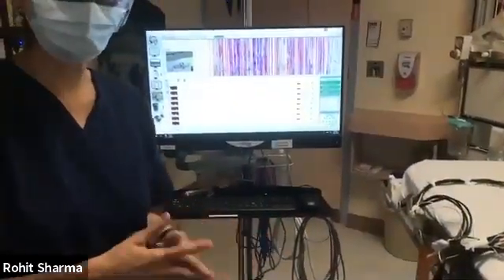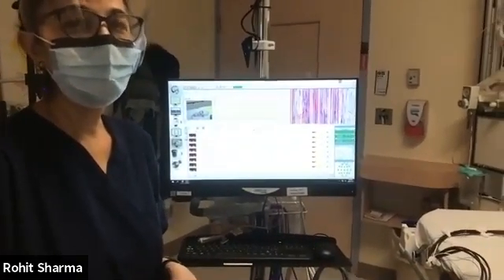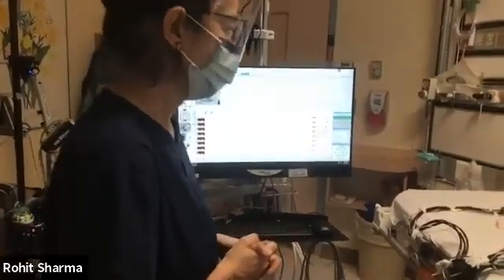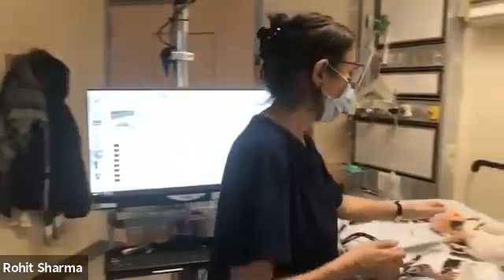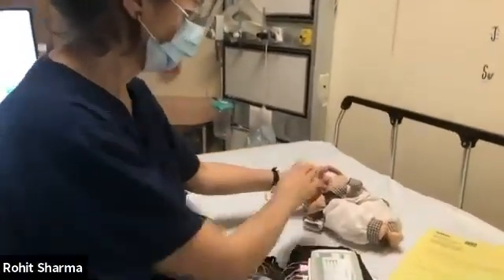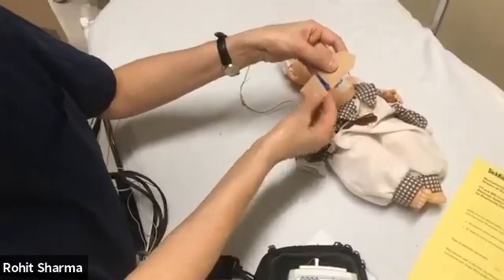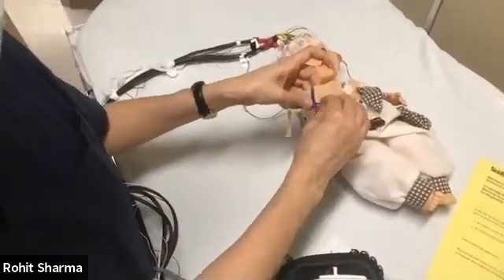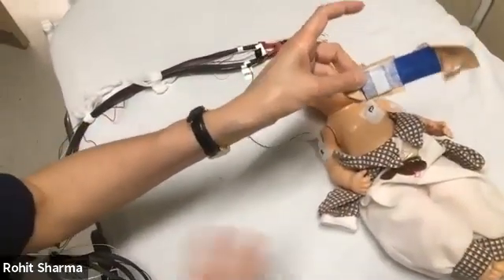Everything is totally disposable. Somebody else had asked, are they disposable? So yeah, all of the electrodes that are on the head are disposable. And then the respiratory monitor is not disposable though. But the ones on the head are disposable. Not all babies will have the respiratory transducer, which is a blue belt on the baby's respiratory area. This is what it looks like. I'm sorry, there's tape on it. It looks like this, and that is not disposable.